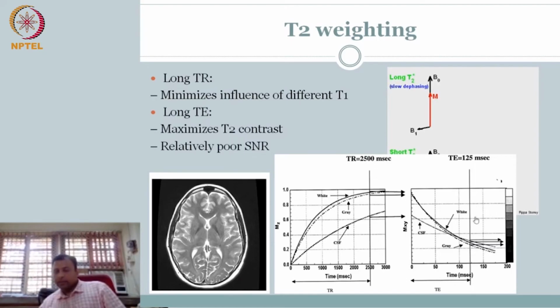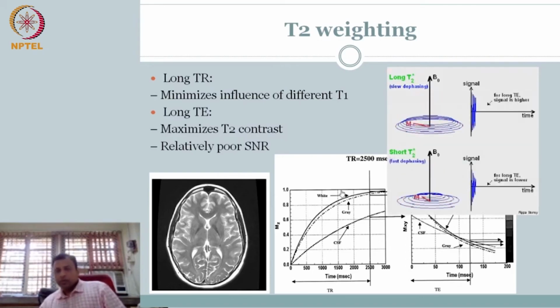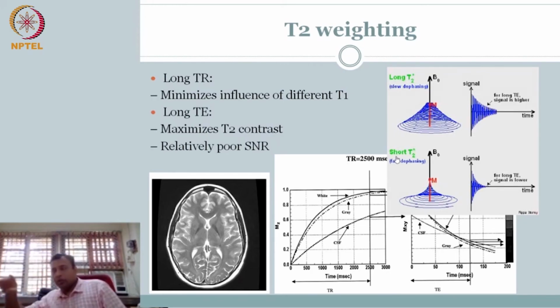Okay, clear? So there is a neat animation here that I would like to show. We covered T2 here, but the animation shows long T2 star and short T2 star. Notice the dephasing is due to both T2 star and T2. T2 star can be rapid, it's the first part, right? T2 is almost always measured based on echo. That's what we saw in one of the sequences, how the initial decay is T2 star, and then you have T2 differences.